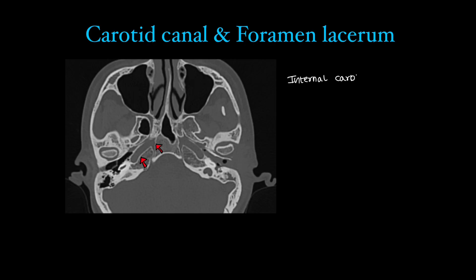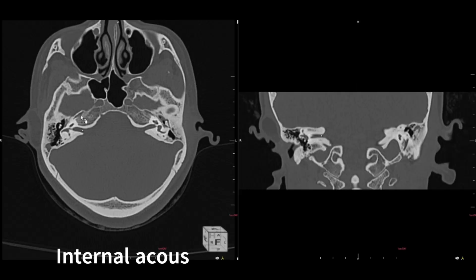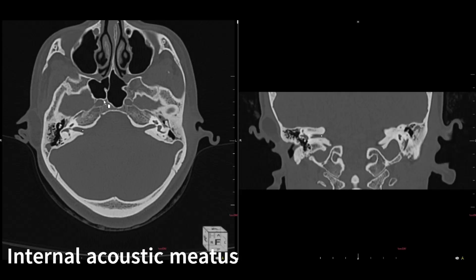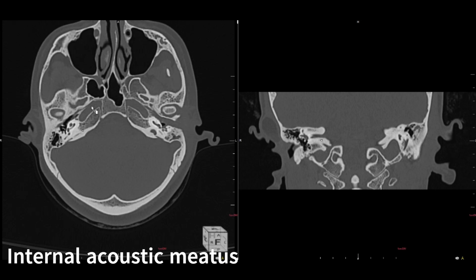Contents of the carotid canal: the internal carotid artery, obviously, and the sympathetic plexus along the internal carotid artery also passes through this canal.